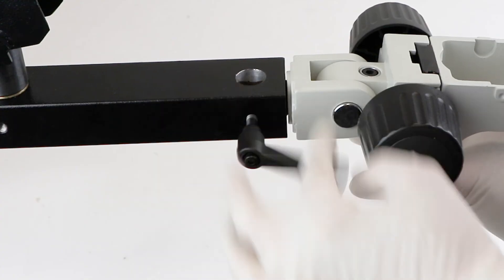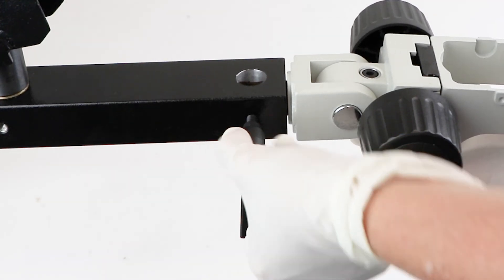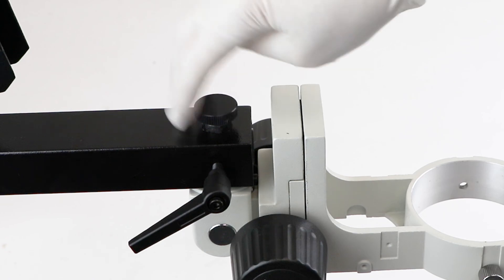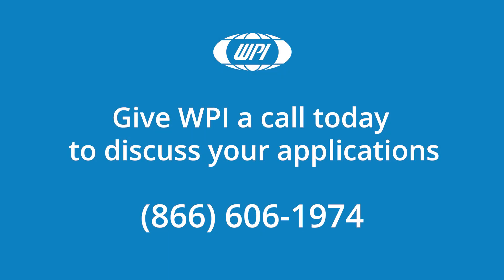Once the focus mount is in position, screw the clutch all the way in to securely hold the focus mount in place. Then reinstall the focus mount screw cap in the end of the focus mount mounting post. If you have any questions, just give us a call.